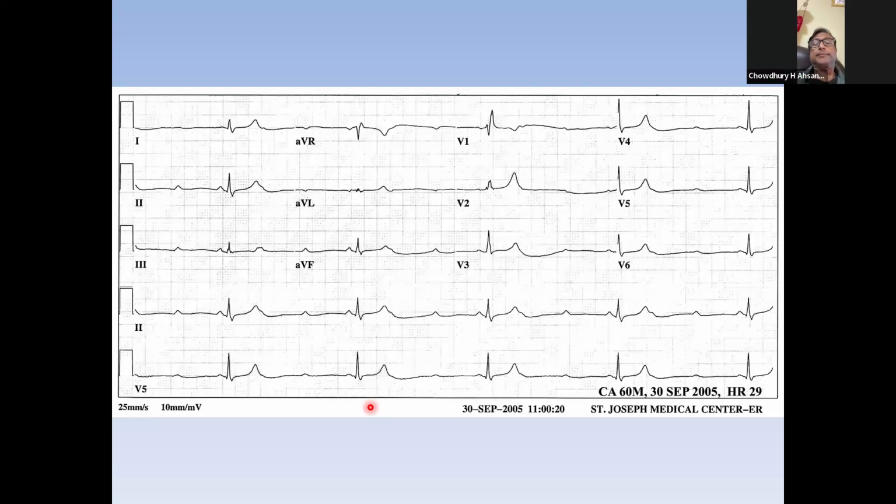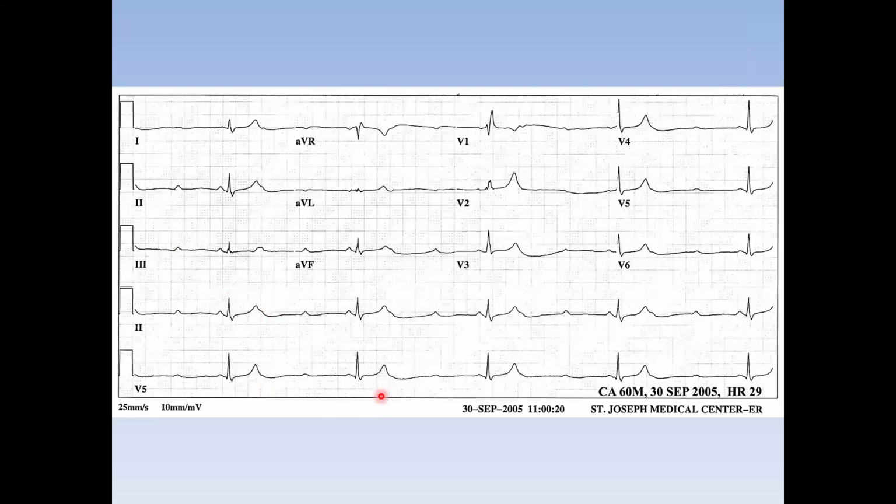So this is the one. If you look at it suddenly, so what is the rhythm? There is a P wave not conducted, a P conducted probably because there is constant, but there is another P wave. So this is 3-to-1 conduction. I'm going to call it high grade AV block, maybe, but probably 3-to-1 conduction. There is some conduction. High grade would be if we have a few more not conducted and some conduction. It's basically a question of semantics.